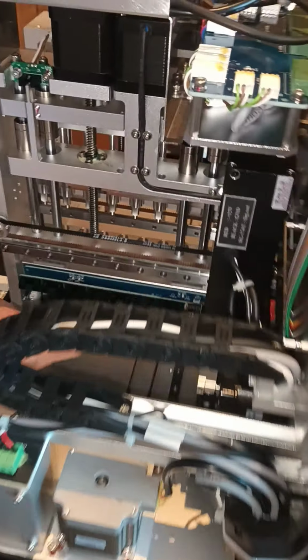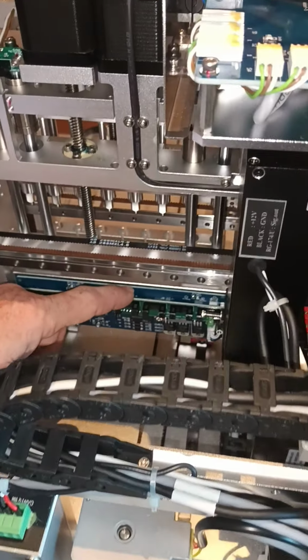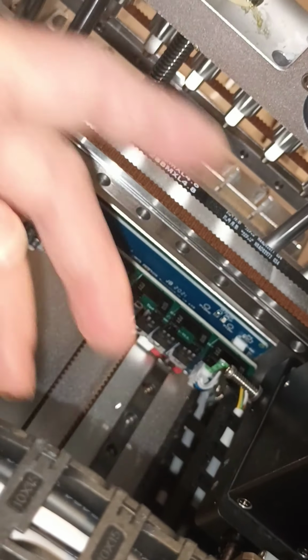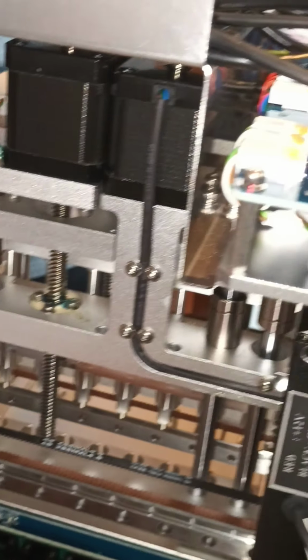Okay. Put the screws in the appropriate bin. Need to take the control board, the optical sensor board, and all these connectors. 1, 2, 3. Still not enough, because in order to change it in a human way, you need to disconnect this cable track from the device and unscrew 2 wires in here on this connector. Why they screwed, don't ask me. That's for your convenience to suffer in the field. Idiotic things completely.